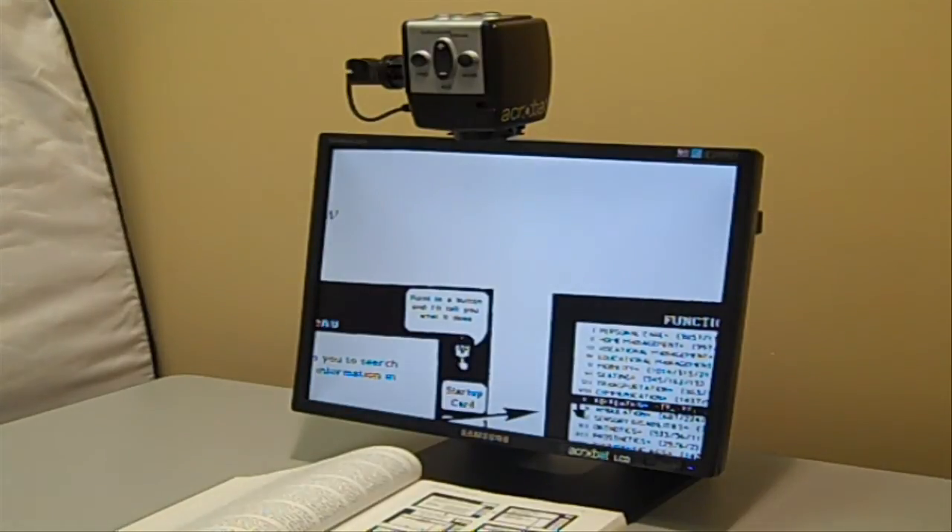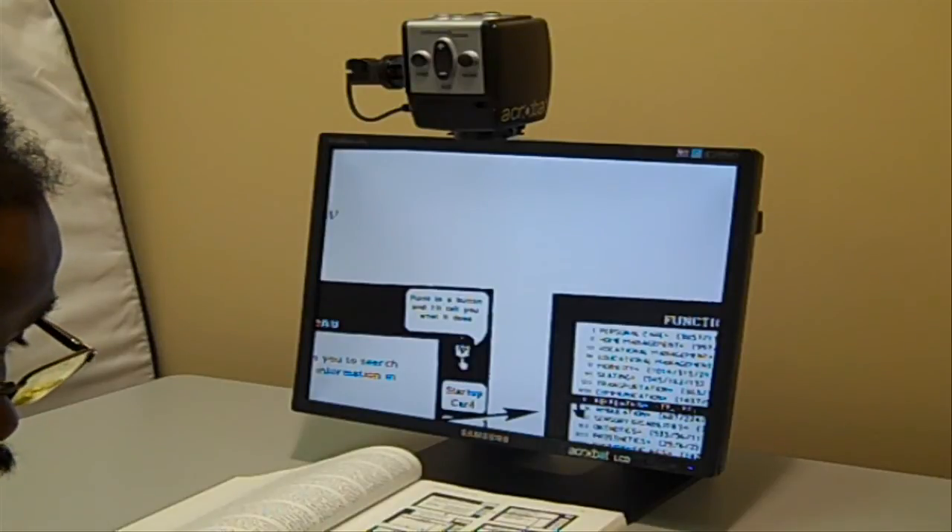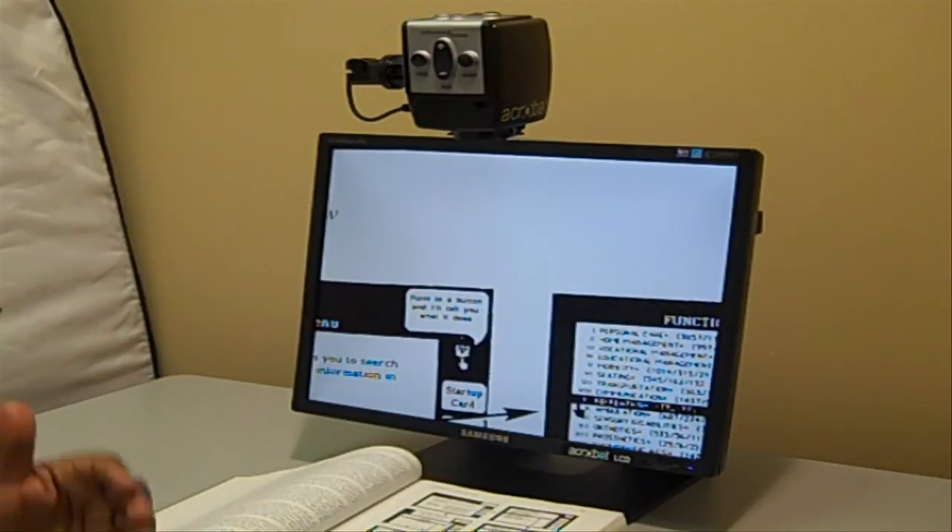It's a portable CCTV. It comes with a wonderful case that you can take around with you. It's a little heavy — about 50 pounds — but it comes on almost like a luggage rack and you can pull it around campus with you to use it.